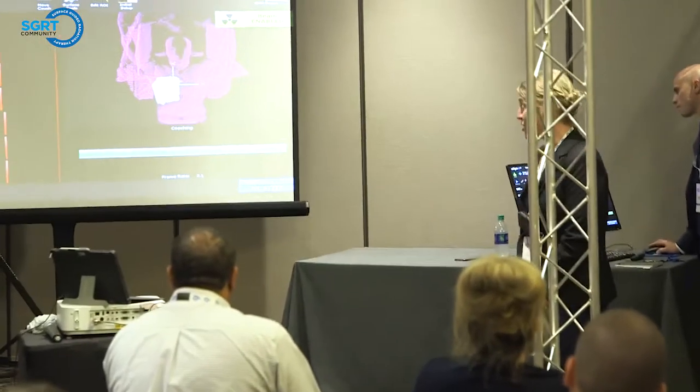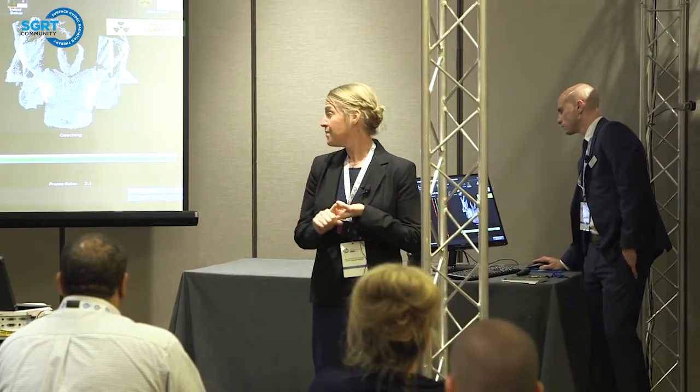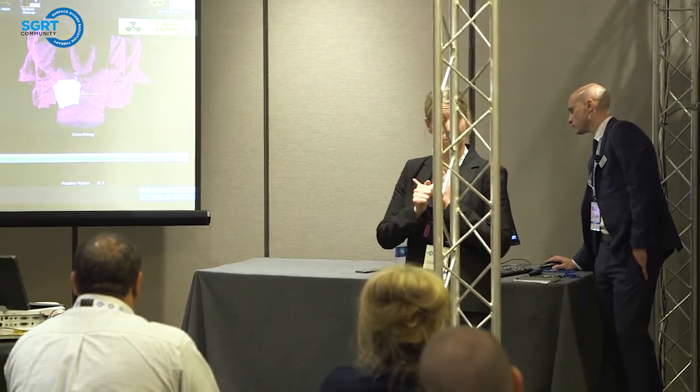Okay, so we're going to start off with the chest wall. And we're going to go through the same steps, lining up our patient. So again, we're going to go right to the treatment isocenter. And then we're going to start running our deltas. So we're going to see where we're at initially in the 6-degree of freedom values.